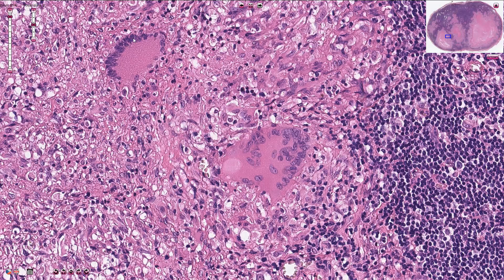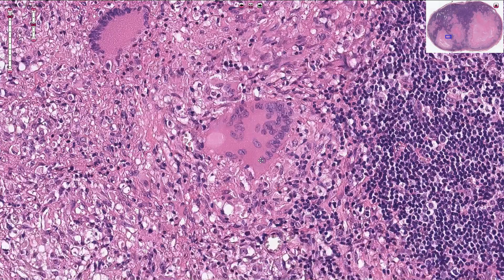We call these Langhans cells. The second type is when nuclei are dispersed randomly in the cytoplasm, or they are packed in one pole of the cytoplasm, and we call these foreign body type giant cells, because we often see these giant cells in cases of foreign body granuloma.